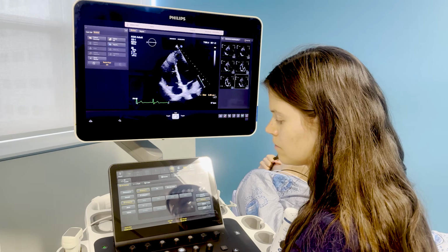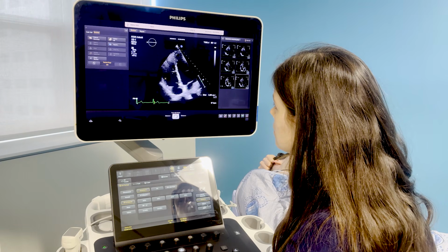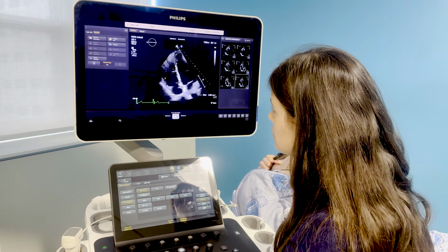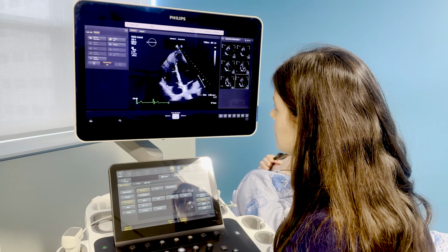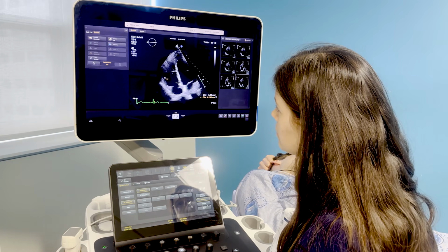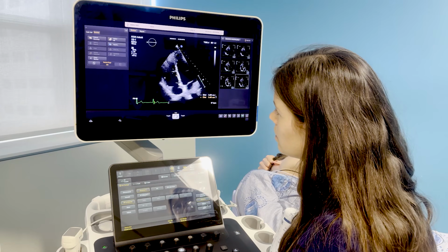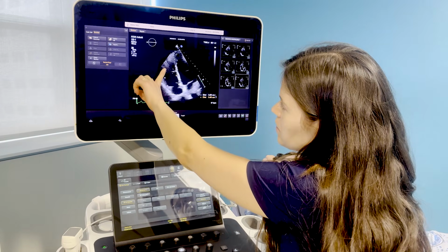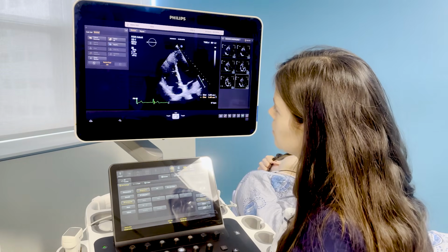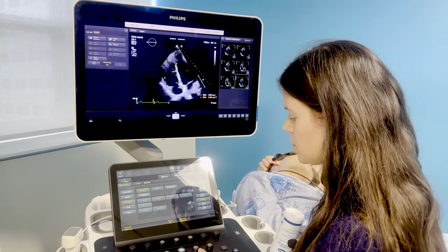Can you show us the RV mid-ventricular diameter? I understand that's midway between the tricuspid annular plane and the apex, parallel to the tricuspid annular plane from the free wall to the interventricular septum. So it would come up kind of like this. Ideally, I would maybe see this area just a little bit better for that measurement. But it'll be along the same plane as my last measurement.